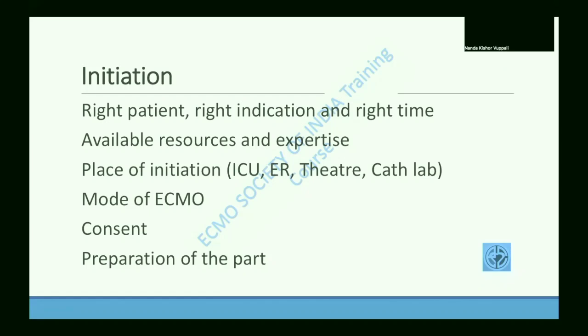And decide what mode of ECMO you're going to go on. Is it going to be respiratory support, or is it going to be cardiorespiratory support, in which case the veno-arterial mode of ECMO? Or is it going to be one of those hybrid modes?